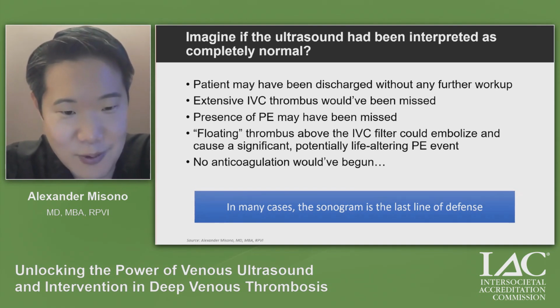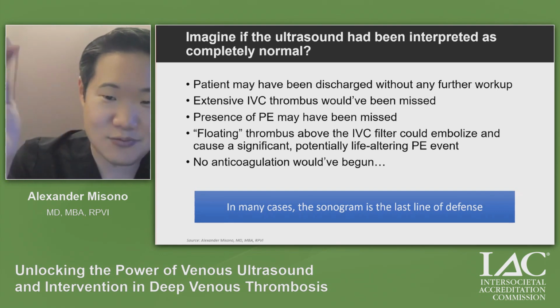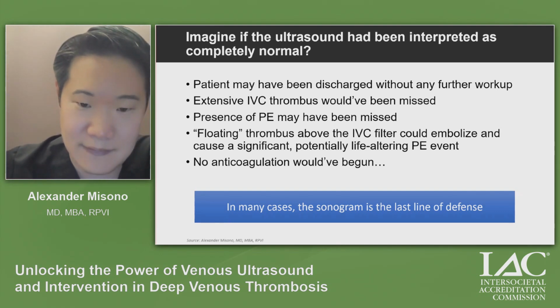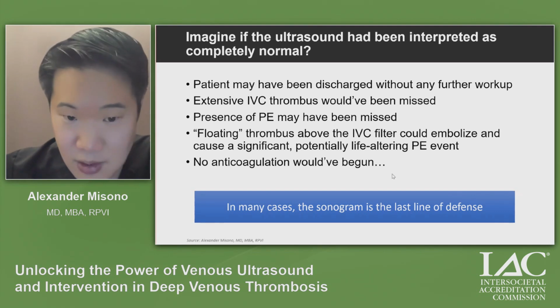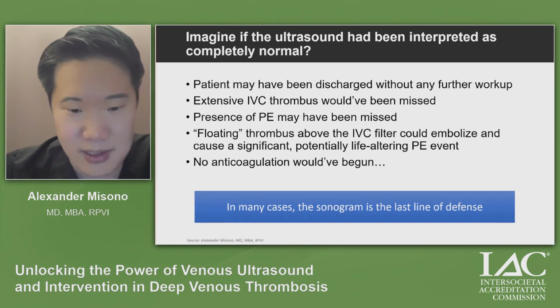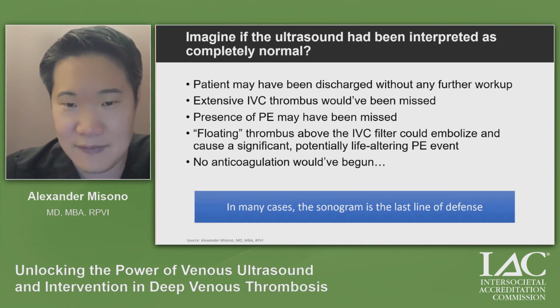There is floating thrombus above that IVC filter, kind of attached to it, probably swaying in the wind. If that were to fall, that could be a potentially life-altering or even life-ending pulmonary embolism. And of course, no anticoagulation would have begun because the diagnosis would have been entirely missed. So again, sonography may be the first and the last line of defense for our patients.